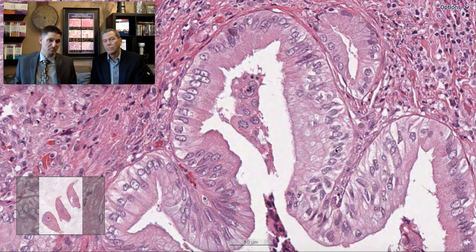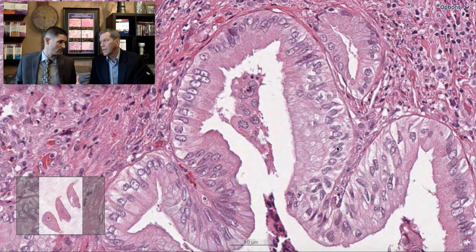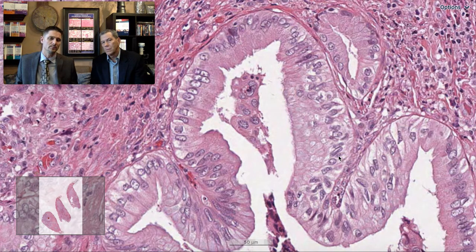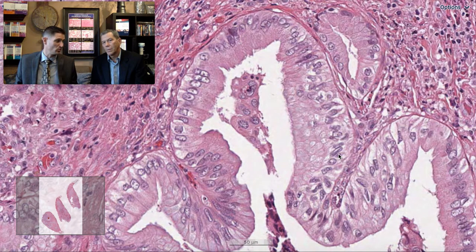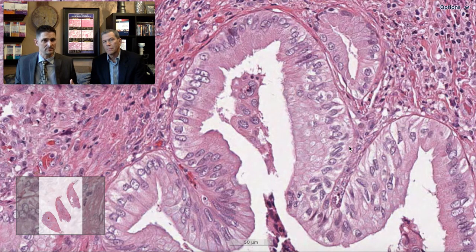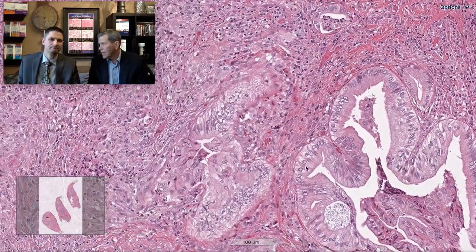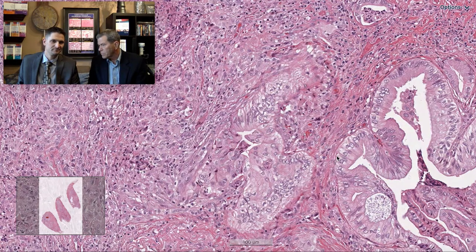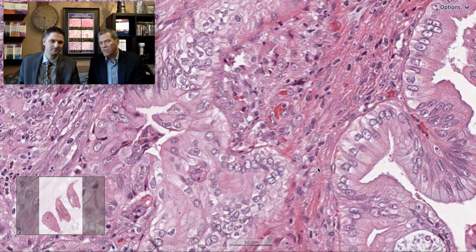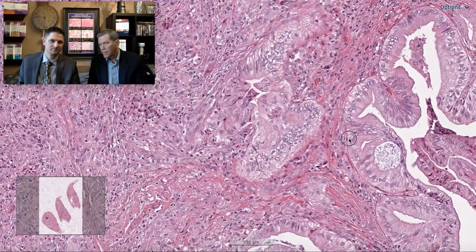CDX2 can also be very helpful. It's positive in about 50% of mucinous lung adenocarcinomas — which might surprise some people. If you have CDX2 reactivity in the lung, that is distinctly abnormal because there's no other reason for it unless you have a mucinous adenocarcinoma, either primary or metastatic. After I diagnosed this, the clinician called and said: 'I have a patient with bilateral infiltrates, one side growing — how do I stage this patient? Is this localized? How do we go about staging?'